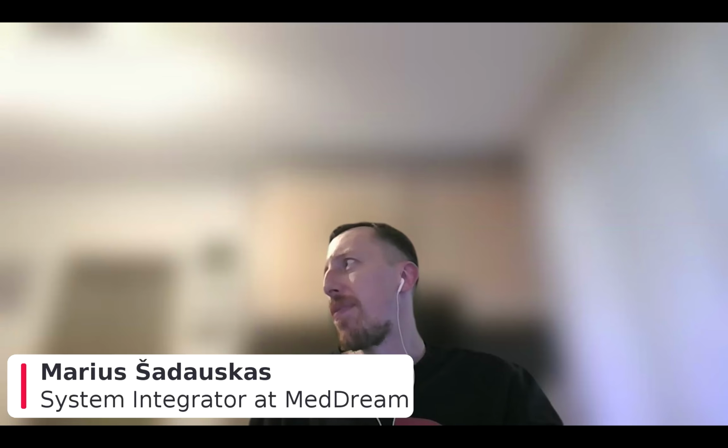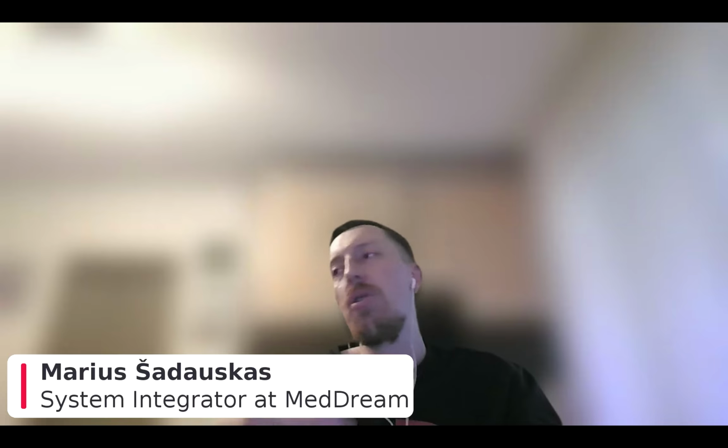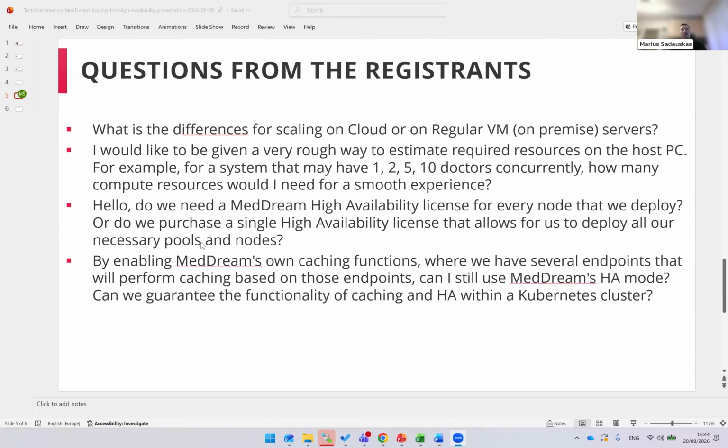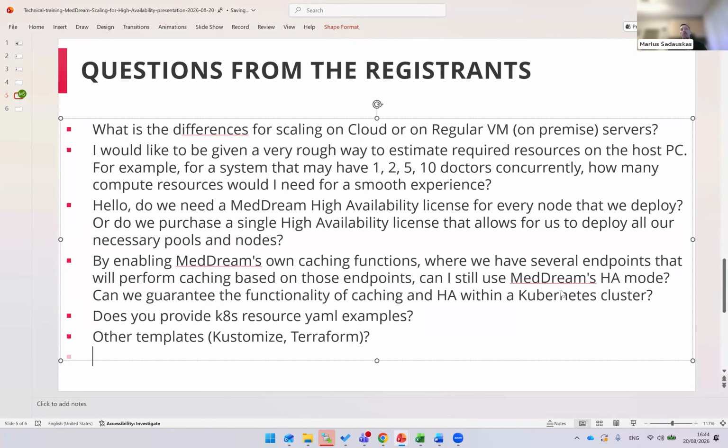So I would say regarding this, you need to think how you would be scaling, or you will just run 3 or 5 MedDream instances, and that's it, and you are not planning to scale them up or scale them down. So I would say maybe this would be the main difference, how you will scale it.